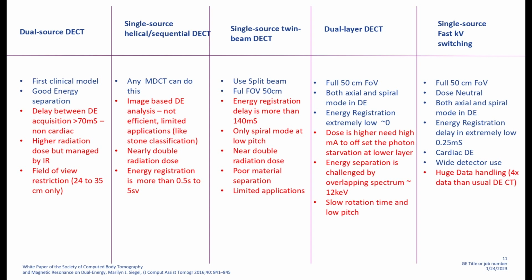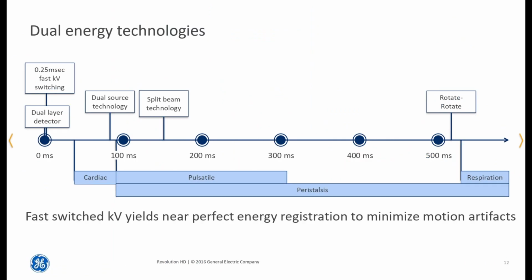That's what you might have looked at in this curve. See, when you are exposing at this point and when you are exposing at this point, the difference is high. So your curve will be more accurate. Whereas if you narrow down the curve, it's very difficult to extrapolate this side or extrapolate that side. Understood?